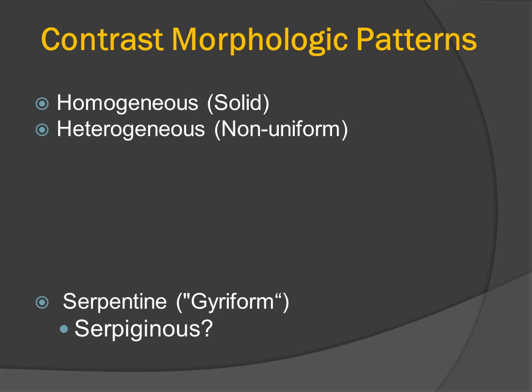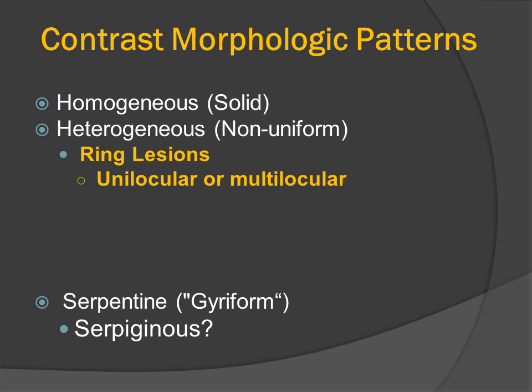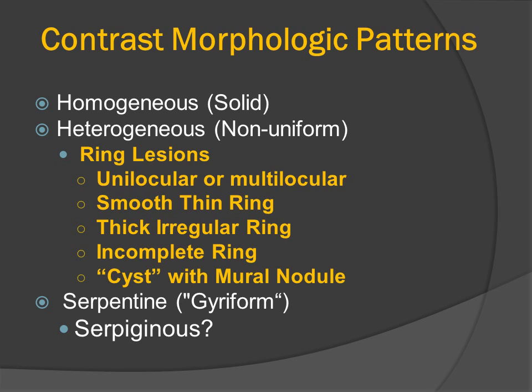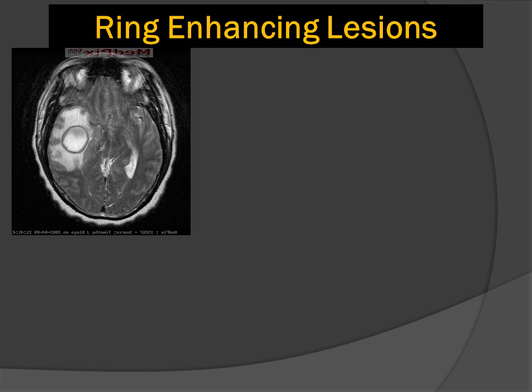There are many different patterns of contrast morphology. We can have homogeneous enhancement, heterogeneous enhancement, and superficial or serpentine enhancement. We can also have ring lesions. They may be unilocular or multilocular, smooth and thin, or thick and irregular. There can be an incomplete ring or rim of enhancement, and we can also have a cyst with a mural nodule.